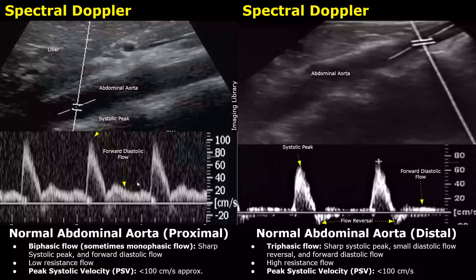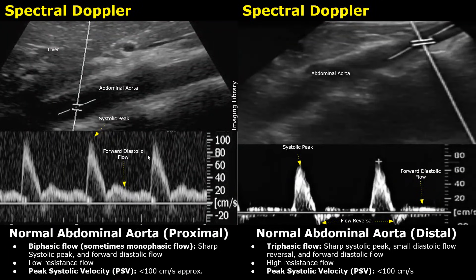Here are the spectral Doppler findings of the abdominal aorta. The proximal aorta is just below the diaphragm and behind the liver. On spectral Doppler, the proximal aorta will usually have a biphasic flow. In some patients, it may show a monophasic flow.